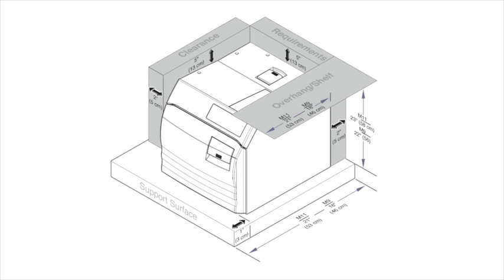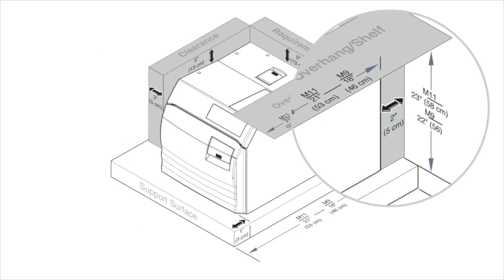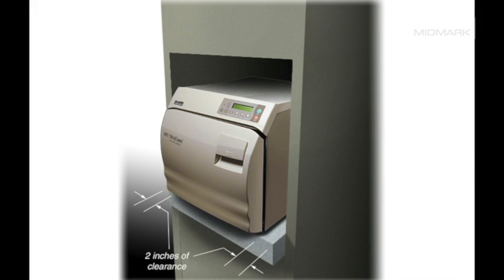This illustration, found in the installation and operation manual, provides critical information for installing the autoclave, including type of support surface, recommended location, and minimum clearances around the unit. These recommendations must be followed to ensure optimum performance of your autoclave.